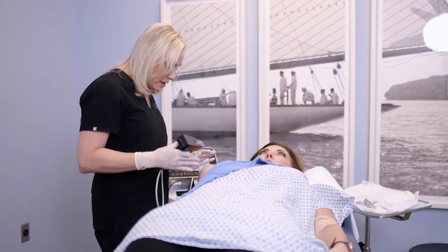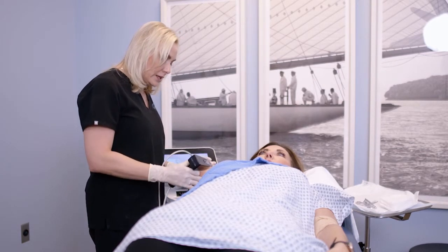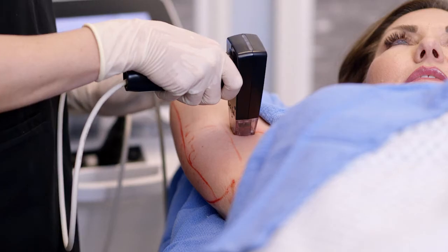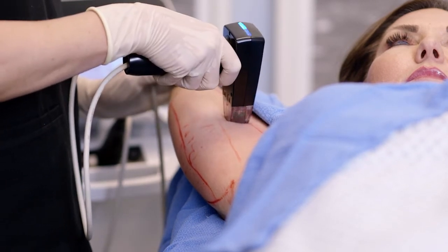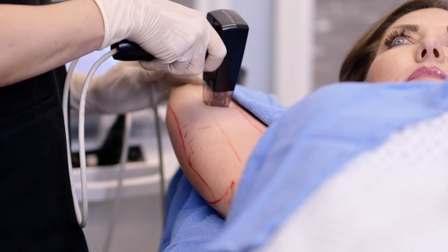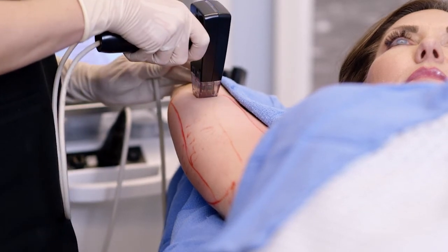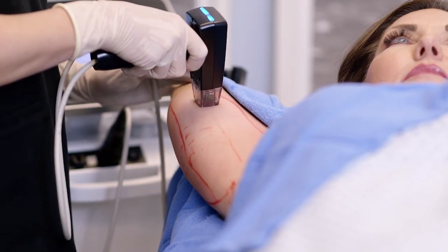Very good. We've already cleaned off all the gel, re-prepped her skin with alcohol because we don't want any of that gel to be on the surface for this particular procedure. So with this procedure, I do double pulsing. Every time I put the handpiece onto the skin, I hit it twice, and I do 50% overlap. And we're going to do 2 passes at every depth. And right now, we're at that 4 millimeter depth.